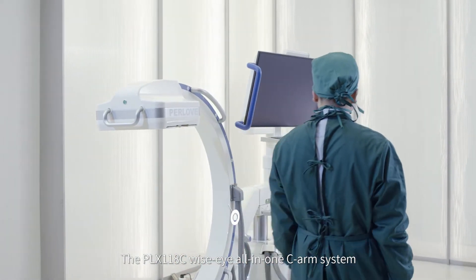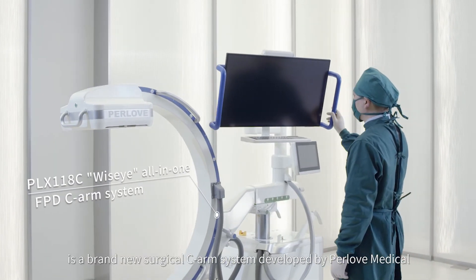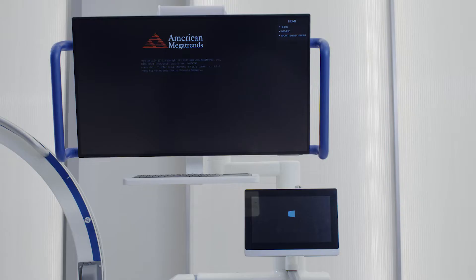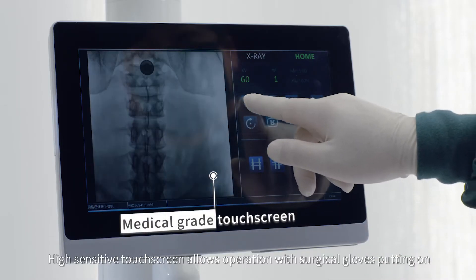The PLX118C WiseEye All-in-One C-Arm System is a brand-new surgical C-Arm System developed by Perlove Medical. Quick start-up design, reducing time for first aid.